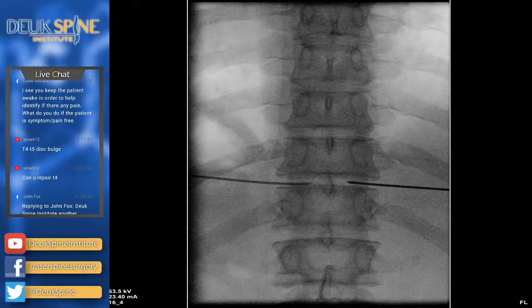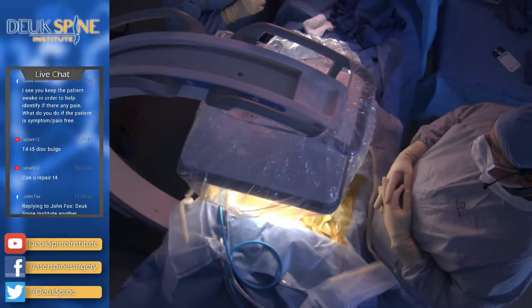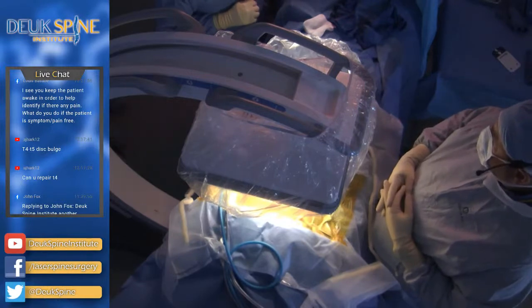We have another question. Well, before I answer the question, I want to ask my patient one more question. So somebody was willing to do a thoracic fusion and laminectomy on you? Were they going to go through the back or through the front? Through the back. You can't fix the herniated disc through the back, except for the way that I'm doing it, through the foramen. So I don't know what they were going to do, but how many days were you going to be in the hospital? 2 weeks? That's about right for a thoracic decompression and fusion, but it sounds like they were going to go through the back and they were going to go around the side. They were probably going to do what's called a lateral extracavitary approach or a transpedicular approach, right? You're an engineer, you're pretty smart, so you probably heard those terms before, right?